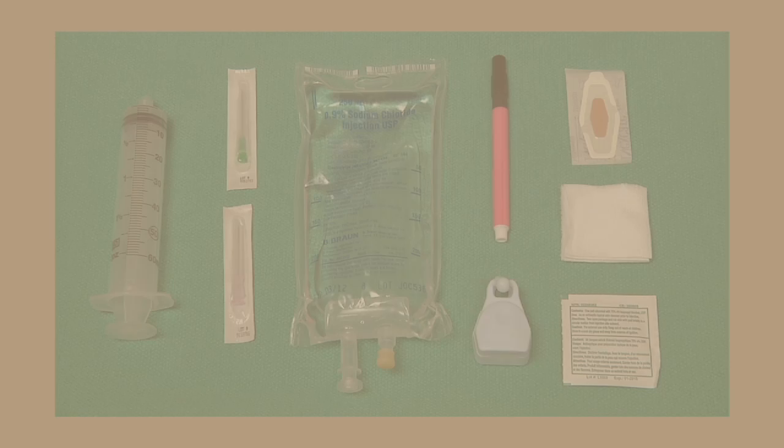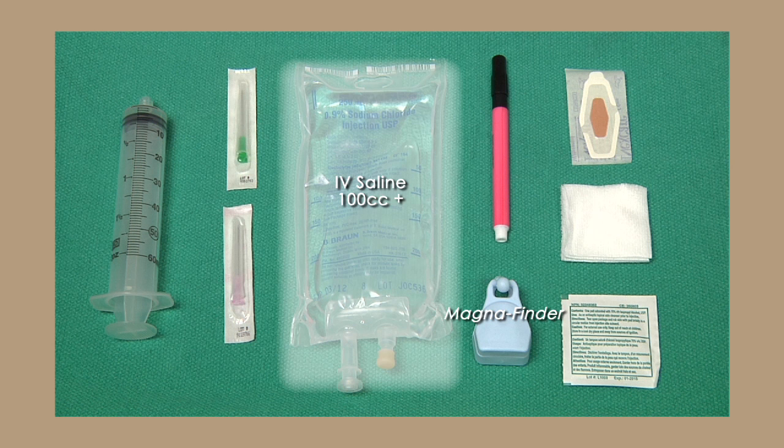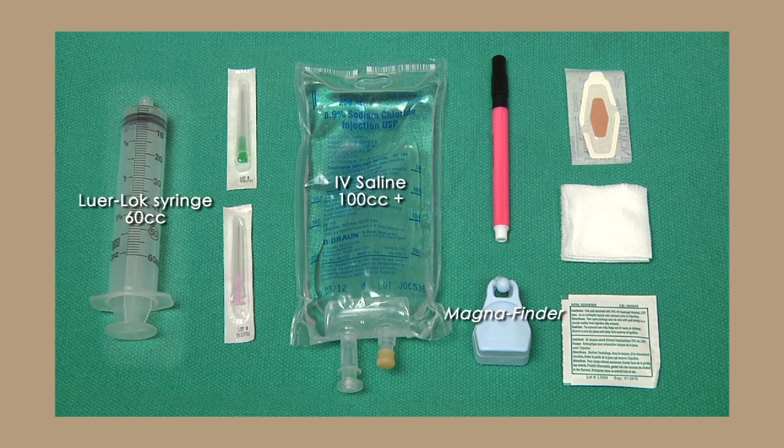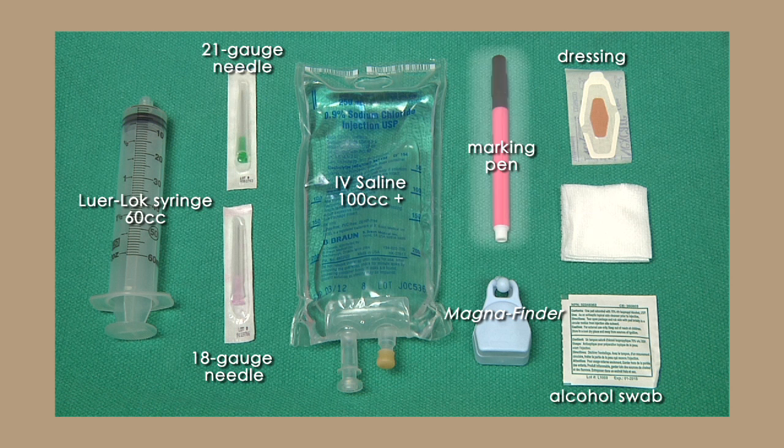The equipment required for this procedure is as follows: the Magna Finder, sterile IV saline bag 100 milliliters or more, a 60 cc luer lock syringe, a 21 gauge or smaller needle, an 18 gauge needle, an alcohol swab or chlorhexidine skin swab, one adhesive bandage or other dressing, a marking pen, and a small gauze.